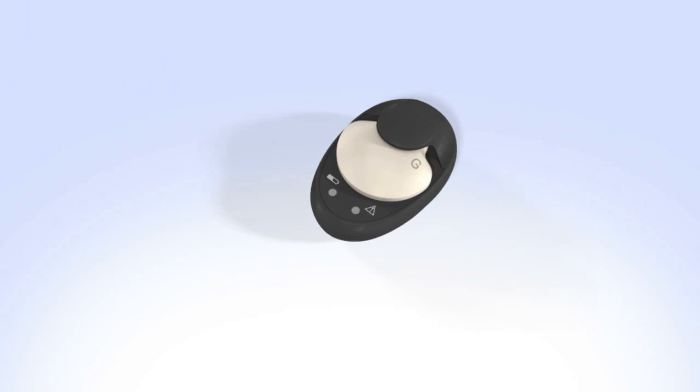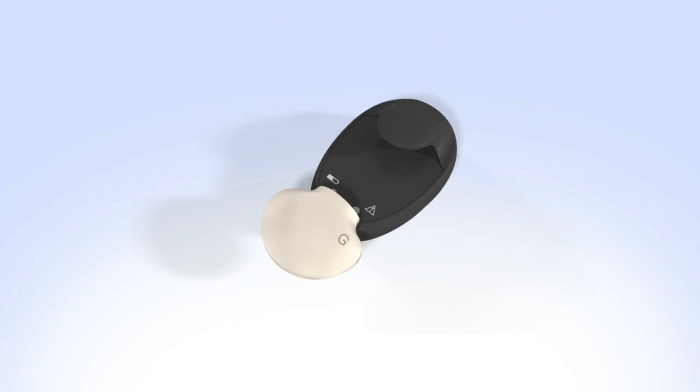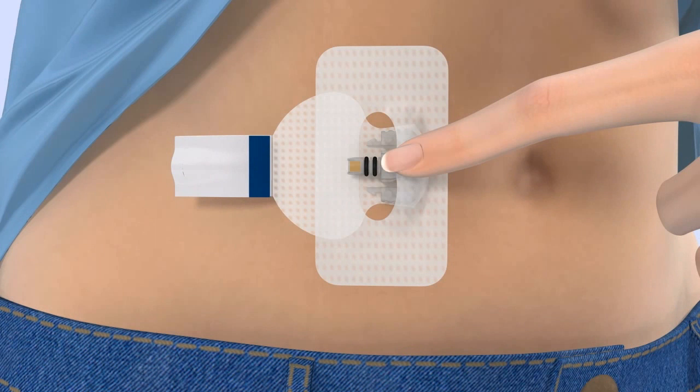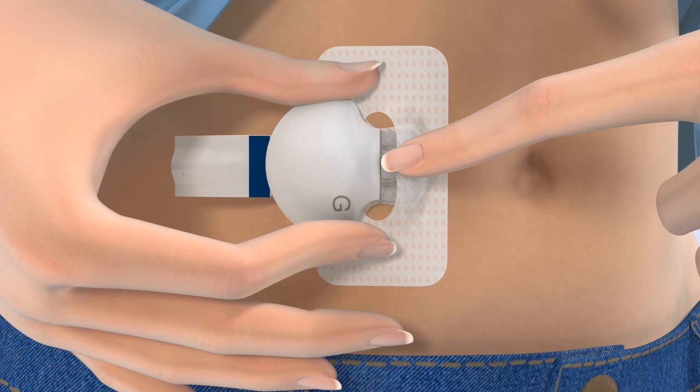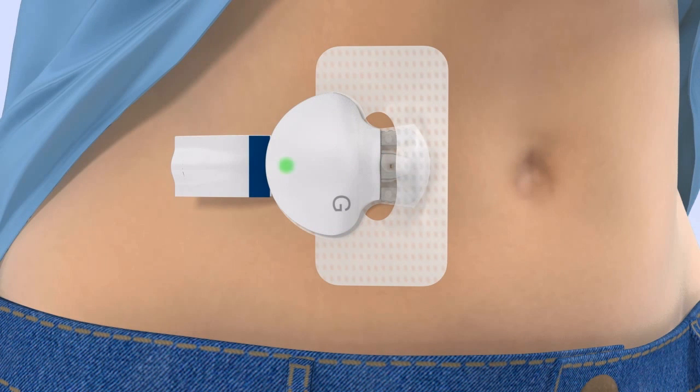To connect the transmitter to your sensor, remove your transmitter from the charger and watch for the green light to flash. With one hand, hold the sensor in place. Hold the transmitter with your other hand and push it onto the sensor — it will click when it is connected. The green light on the transmitter will start flashing within 10 seconds, flash for a few seconds, and then turn off. If necessary, use a mirror to see the green light. If the green light on the transmitter does not flash, disconnect the transmitter from the sensor and place it back on the charger until it is fully charged, then reconnect the transmitter to the sensor.